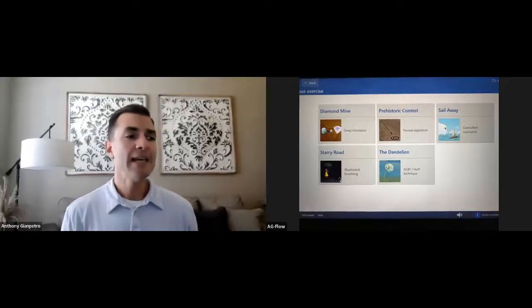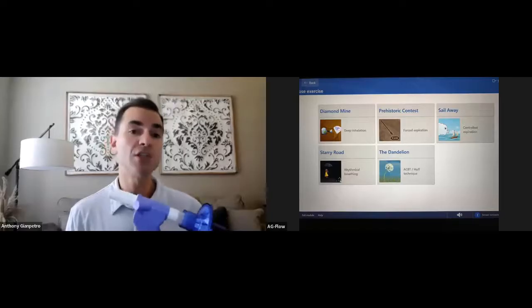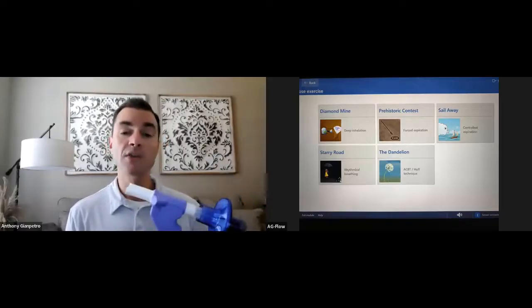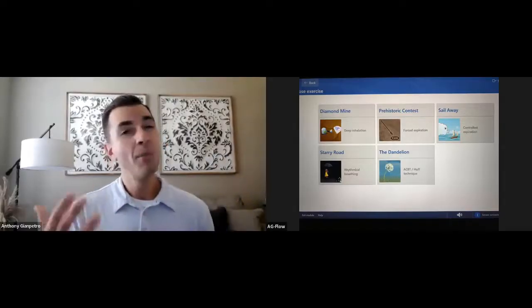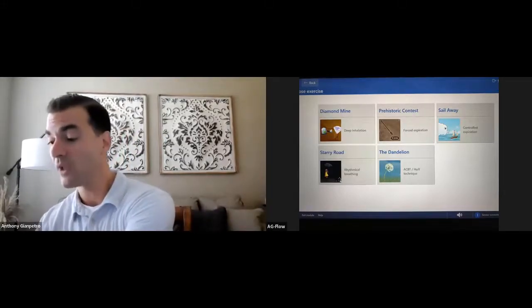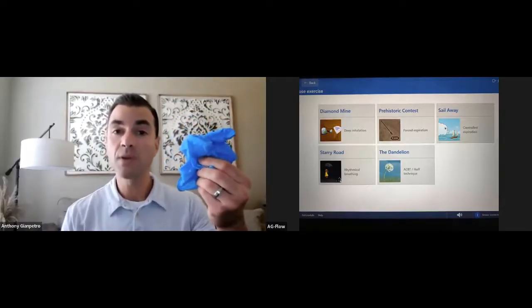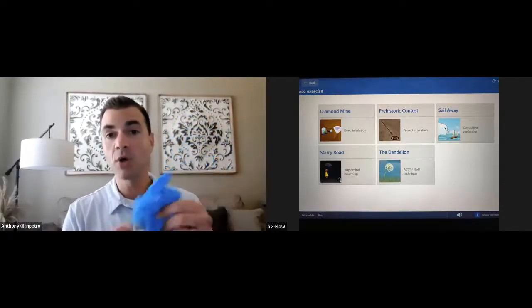And I apologize if you haven't seen this before. I don't have time in this presentation to break down how Flow works and how you set it up and how you clean it. But a couple of quick tips, just as a reminder, in case you do have the unit in front of you and you have been acclimated to this. Always helps to have a pair of gloves on at all times when you're doing this, both for you and for the patient, of course.